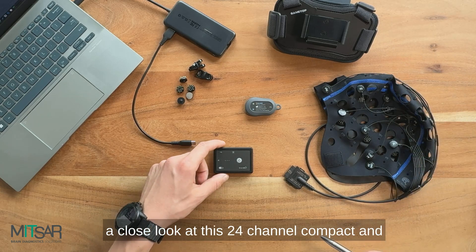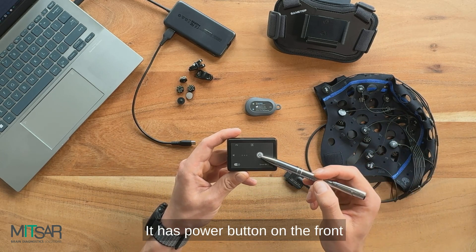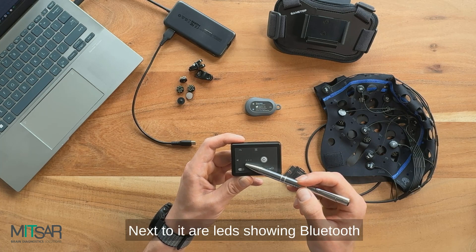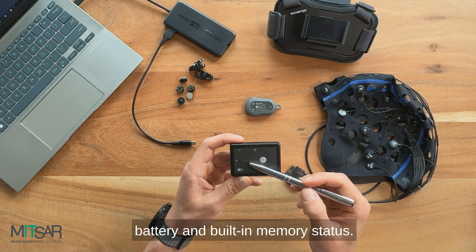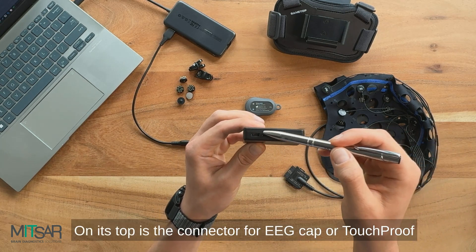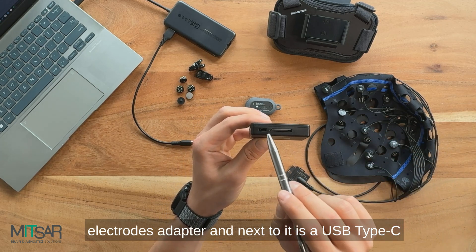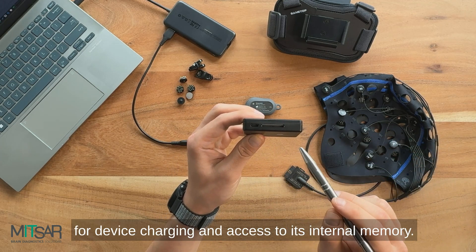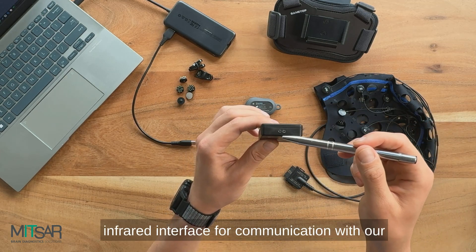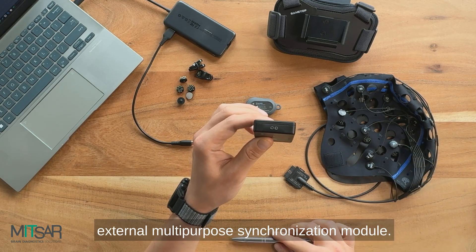Let us have a close look at this 24-channel compact and lightweight wireless EEG amplifier. It has a power button on the front panel to turn it on and off. Next to it are LEDs showing Bluetooth, battery and built-in memory status. On its top is the connector for EEG cap or touch proof electrodes adapter, and next to it is a USB Type-C for device charging and access to its internal memory. On the side it has an infrared interface for communication with our external multi-purpose synchronization module.